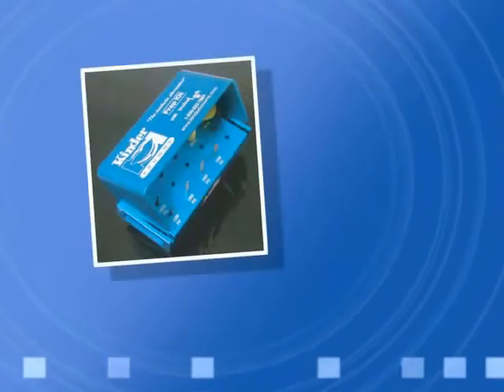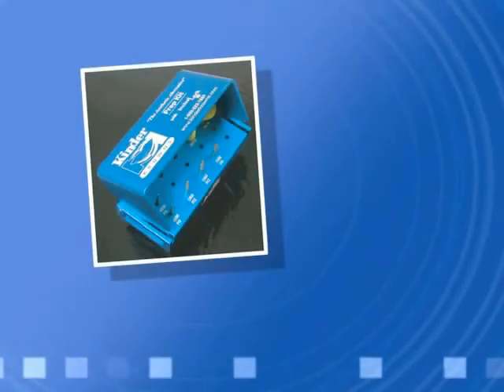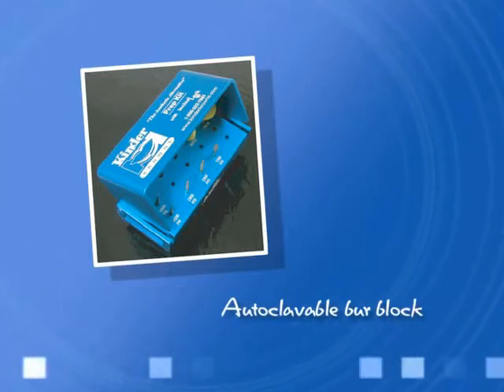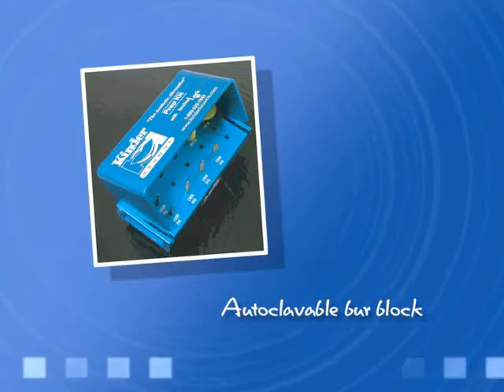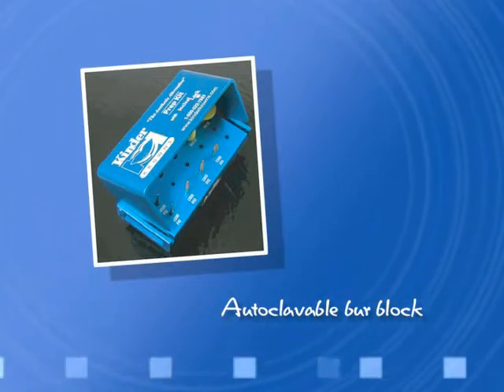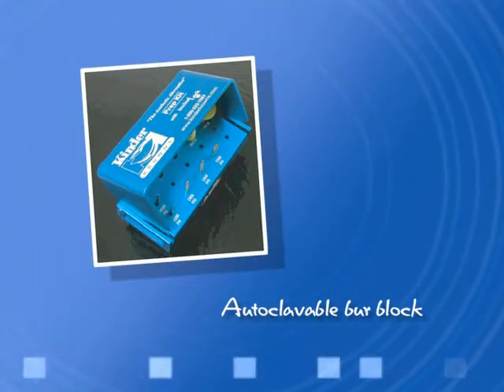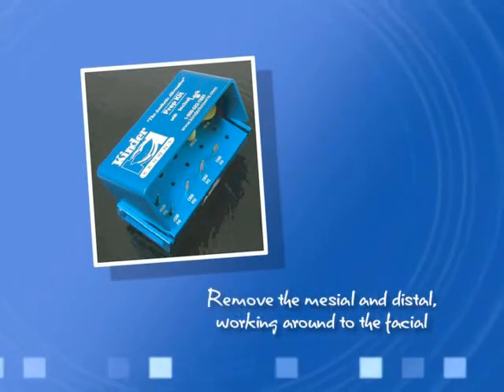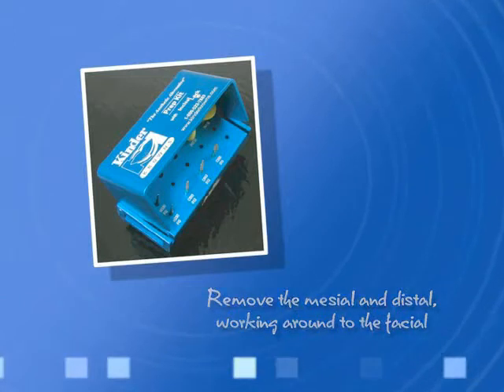Any carbides or diamonds can be used for preparation. We've put together a prep kit in an autoclavable burr block to help in burr selection. Initial preparation is most commonly done with a 330 carbide or 855 tapered diamond, depending on preference. Remove the mesial and distal, working around to the facial.